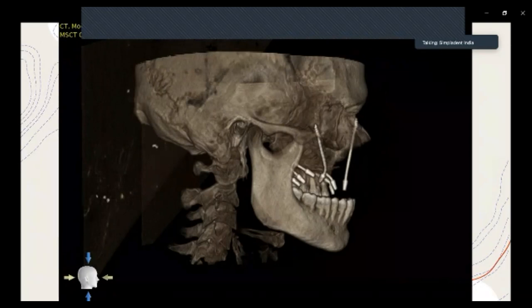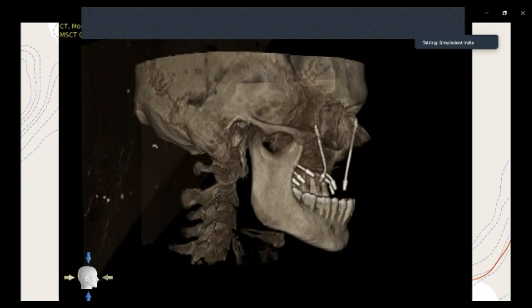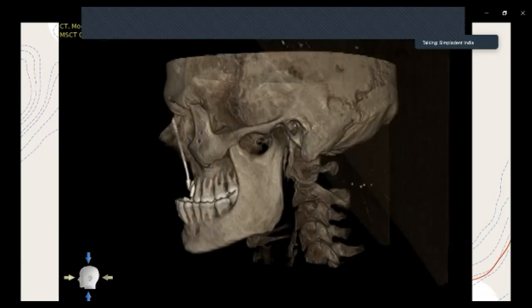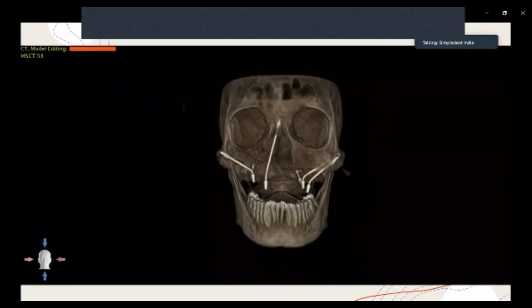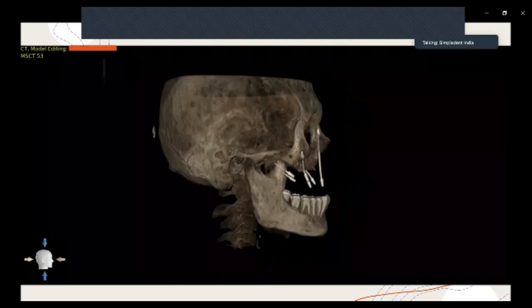So you can see there was the part of the implant where bone was available, and the zygomatic process was available. So we engaged the zygomatic process on the left hand and right hand side. The glabella is there, triple pterygoid is there. Okay. That's case 6. Again, double pterygoid, one single, double zygoma, pterygoids, glabella implant, as you can see.